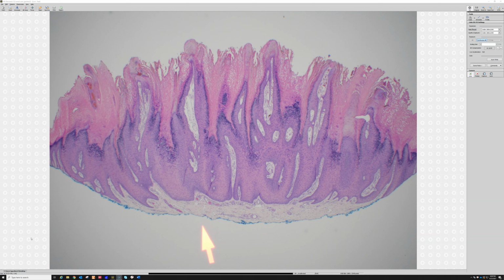Sometimes if I'm having trouble deciding wart versus seborrheic keratosis, for example, or something else like that, the presence of nice in-toeing will make me say, I'm going to call it a wart, a verruca. Okay, so those are the big features from low power. Oh yeah, and also the corneal layer. There's hyperkeratosis. As these are keratinocyte proliferations, they tend to produce a lot of keratin, which results in a thickening of the stratum corneum, or hyperkeratosis.